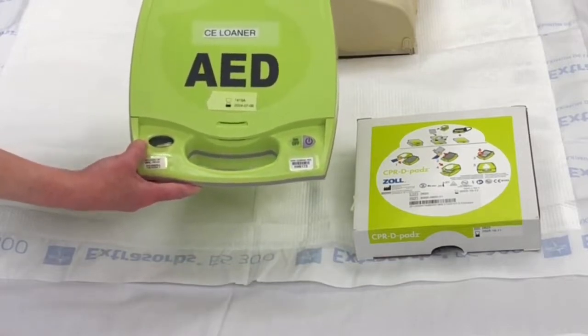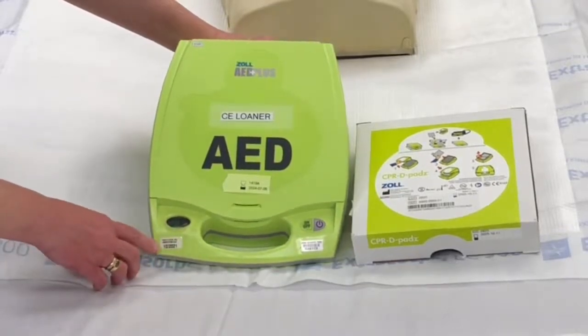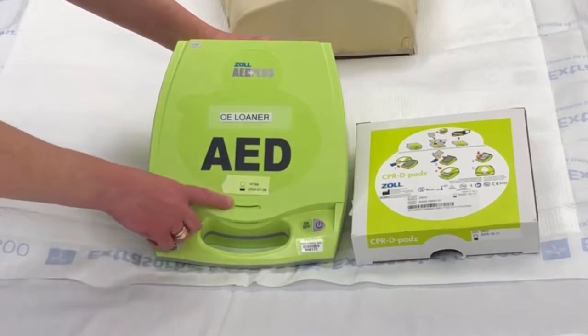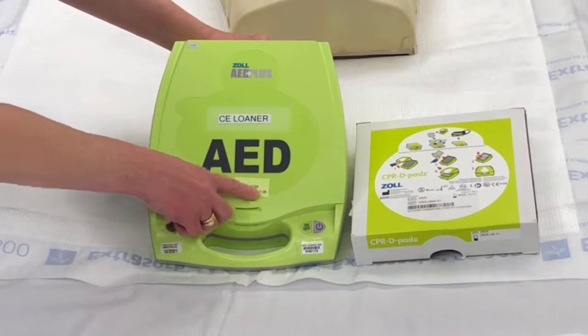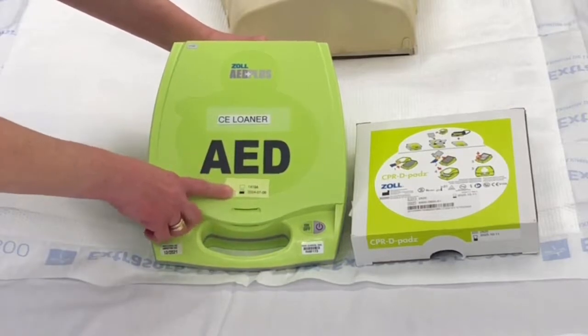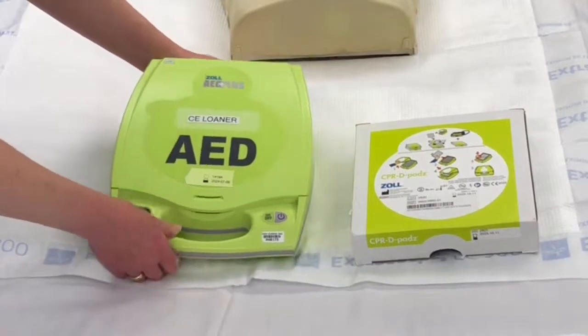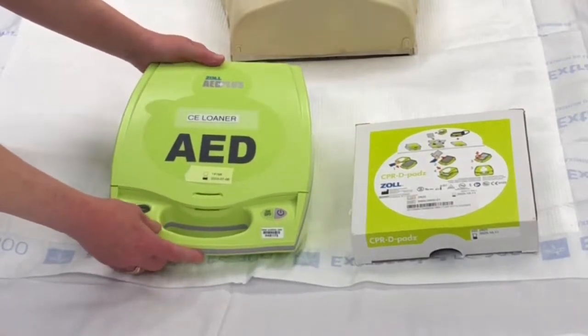And as part of our readiness check, we look to see the dates of the next preventative maintenance and when that is, and then the expiration date of the pad that's loaded, which is placed on this yellow sticker here. If we use the AED, we call 688-9000 to have a new pad loaded.